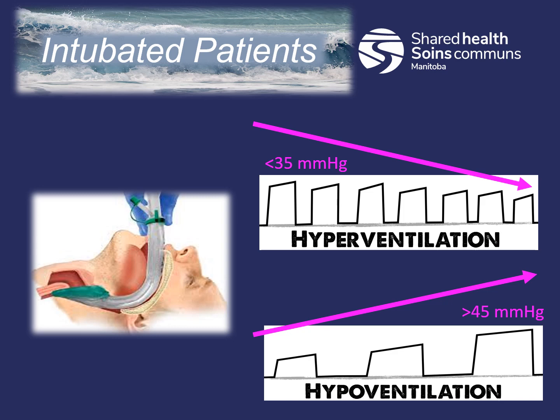Each squeeze of the BVM generates a waveform and displays feedback on respiratory rate. So let's use the end-tidal CO2 to guide ventilation to patients at 10 to 12 ventilations per minute and deliver only enough tidal volume needed to make the chest rise. It's also important to allow patients to exhale completely before delivering the next ventilation, even if the respiratory rate must be lowered to achieve this, which can be monitored by viewing the length of the capnography waveform. Waveform capnography is a reliable tool to help make accurate treatment decisions and adapt to changing conditions.